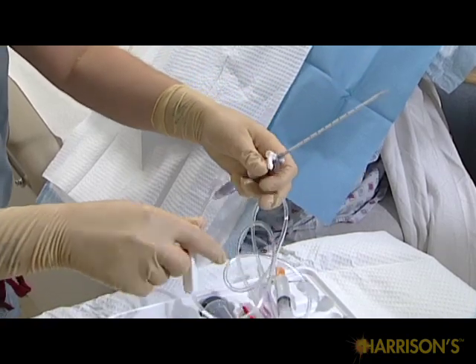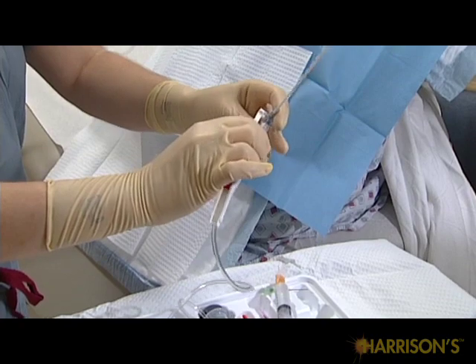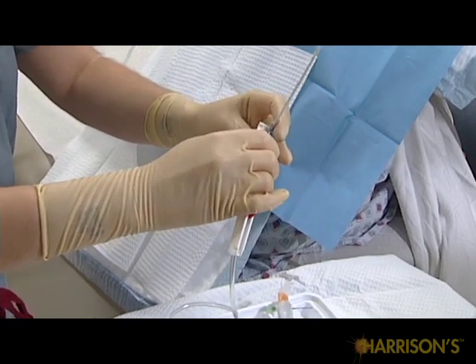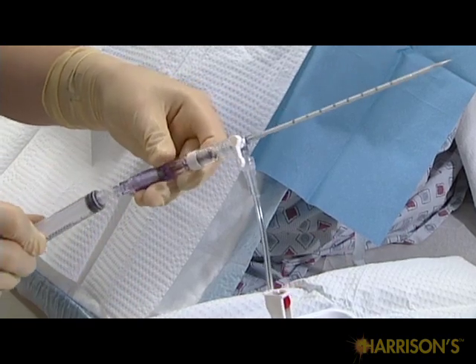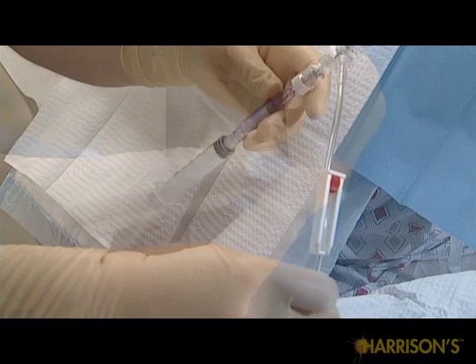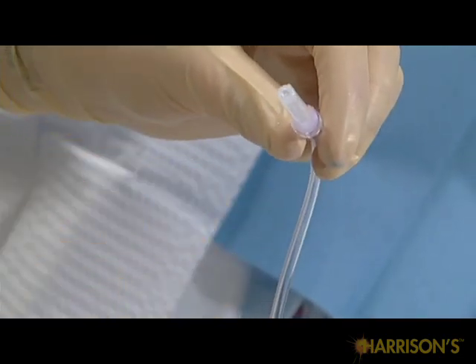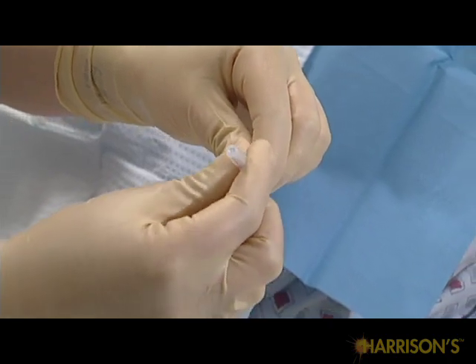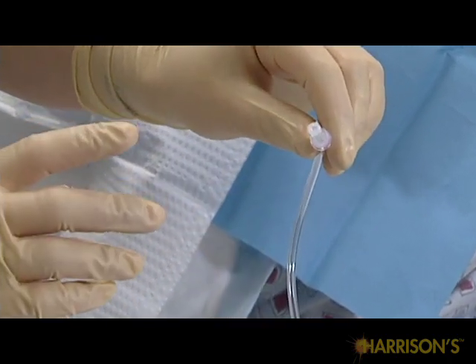While waiting for the skin to anesthetize, connect your 18 gauge needle catheter to the 3-way stopcock and the 3-way stopcock to a 10 cc syringe. Also, connect one end of the pressure tubing to the 14 gauge plain needle for connecting to the vacuum-sealed container.